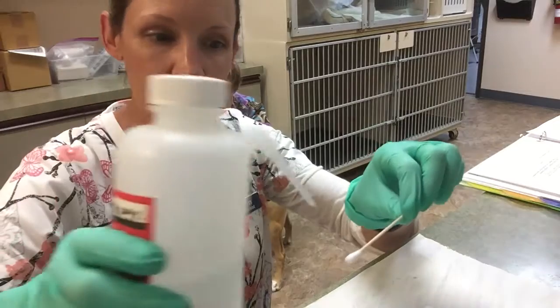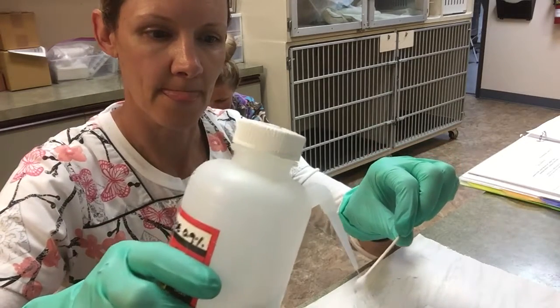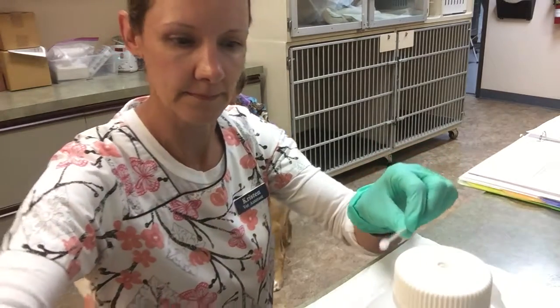I'm going to start off by moistening my swab with some saline. Okay. I'm going to reposition the camera so you guys can see what I'm doing here.